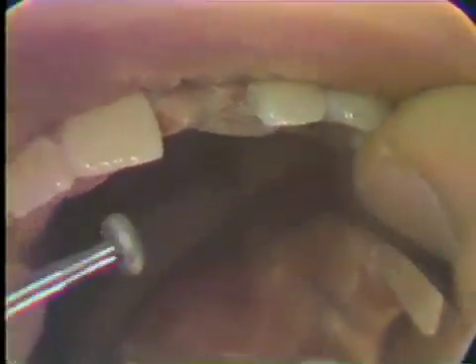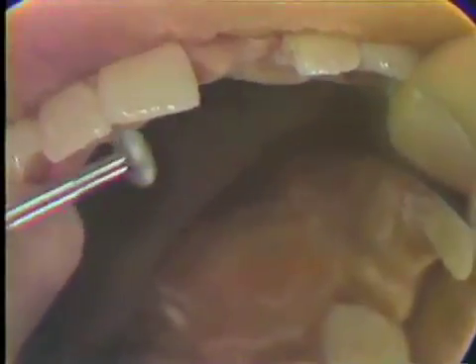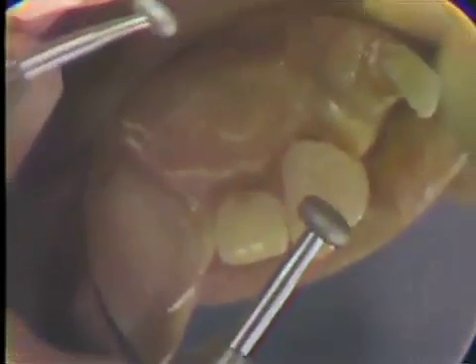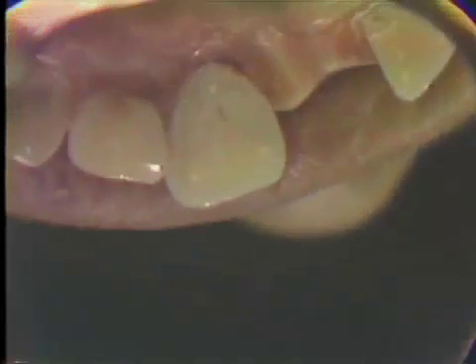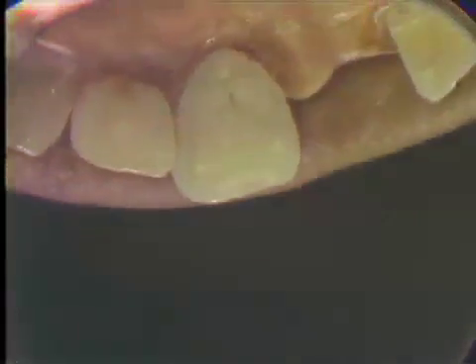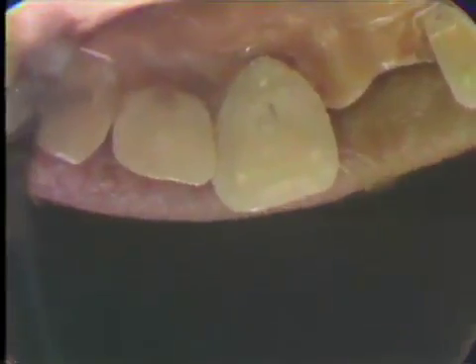Now we'll hollow grind the incisal edge. Rather than having a straight bevel, this incisal edge will be hollowed out. We do this so that from the anterior it doesn't show. You can see that we've established that bevel, which is really an arc — it's curved. So there's extra gold on that incisal edge to protect this very fragile tooth.